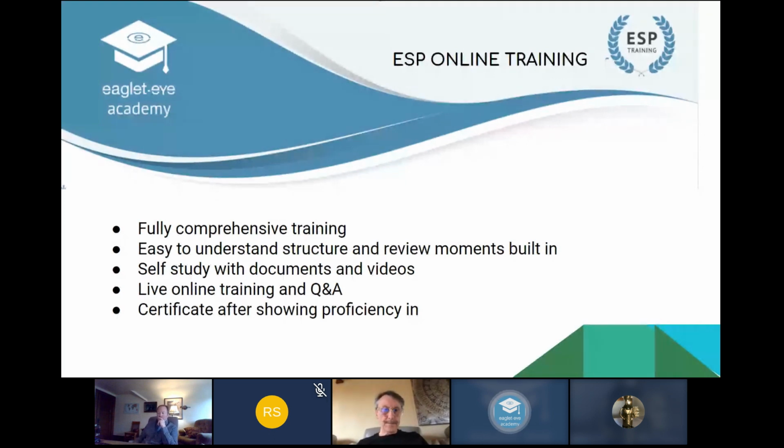In a structured way, we'll involve the practitioners with some self-study, with documents and videos that we created, but also some live sessions with Zoom or Hangouts to do real coaching and direct training with them. We feel we have a system now that will be equally quick for our users to get up to speed.